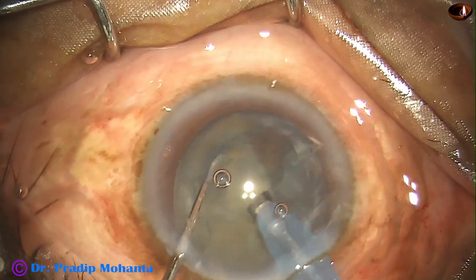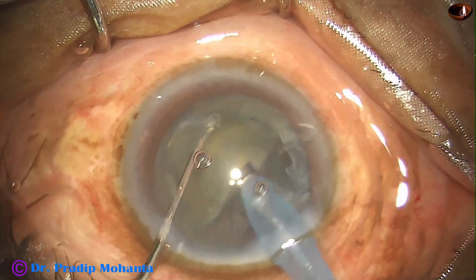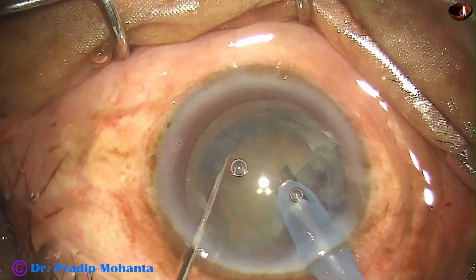It is a very soft cataract. Nucleus sclerosis, you can say, is about grade 2 in this case.